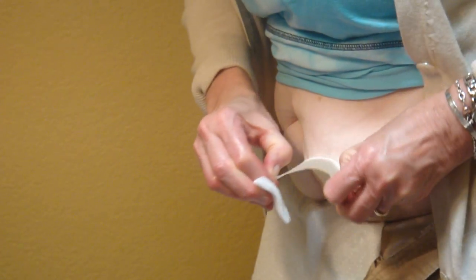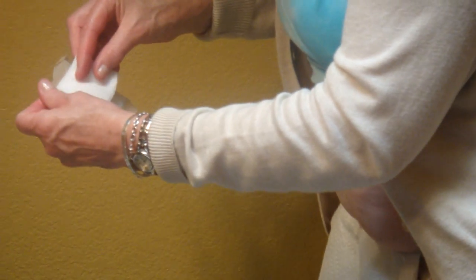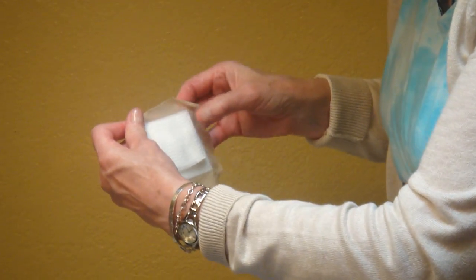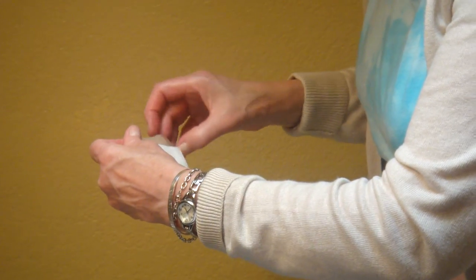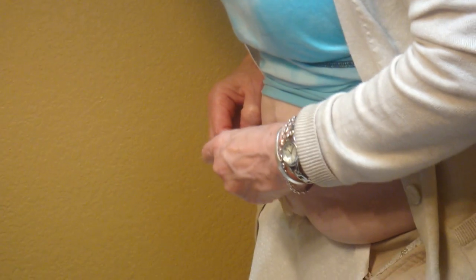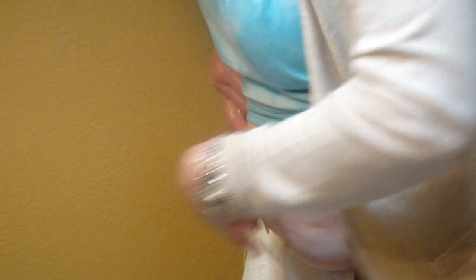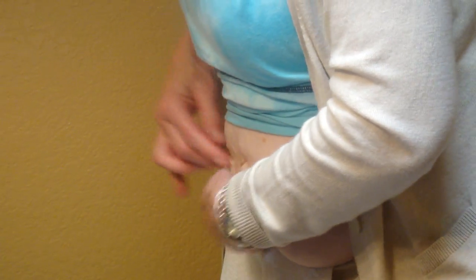I'm going to take a little piece of tissue and just dry off the area around the stoma. If you don't get it dry around there, the dressing will not re-stick. I'm going to take my gauze, take this dressing off from the other side of my abdomen, and put my new gauze there. That's going to hold right there because this surface is also sticky. This allows me to continue to reuse this particular dressing over and over again throughout the day, because some of these items can be kind of pricey, even if your insurance is helping you pay for them.